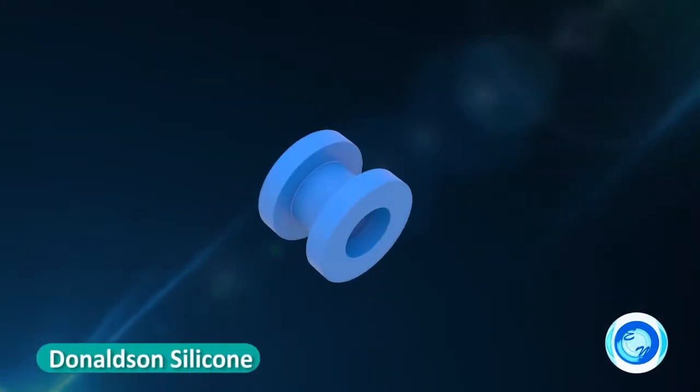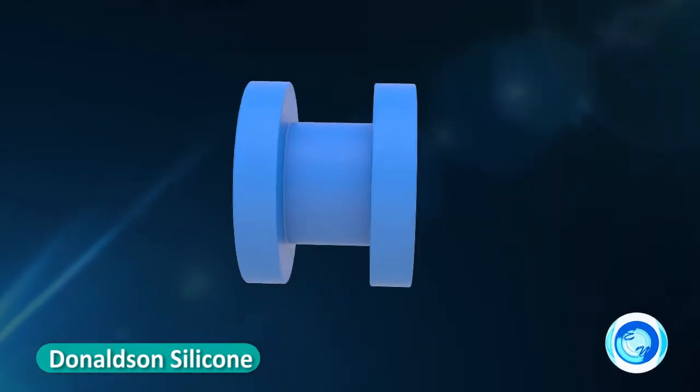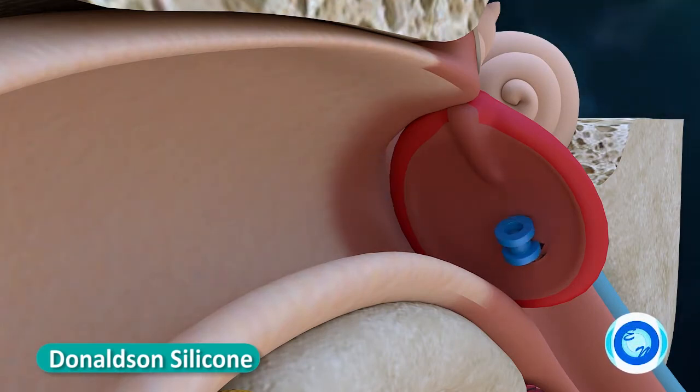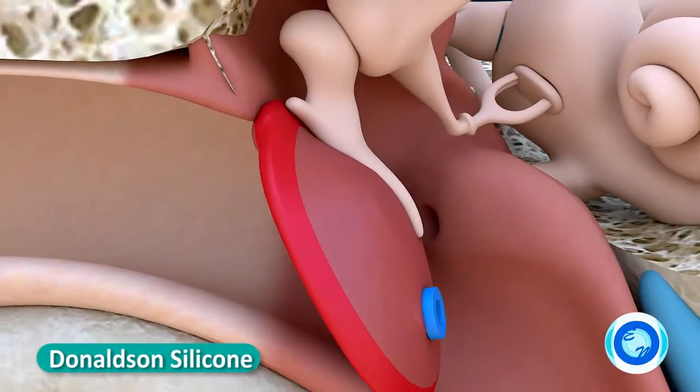Donaldson tube: silicone material, with an inner flange diameter of 2.3 mm. This facilitates insertion in a smaller incision, as the silicone material can be compressed for easy insertion. Short-term ventilation tube.